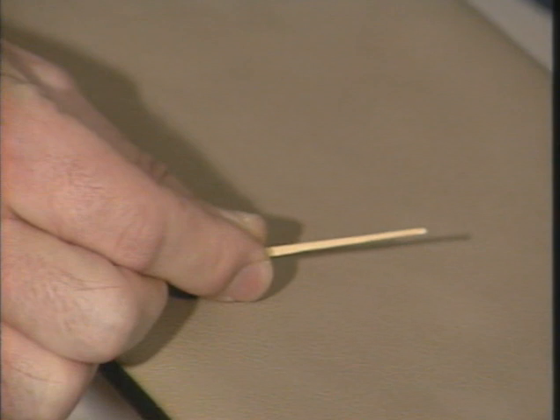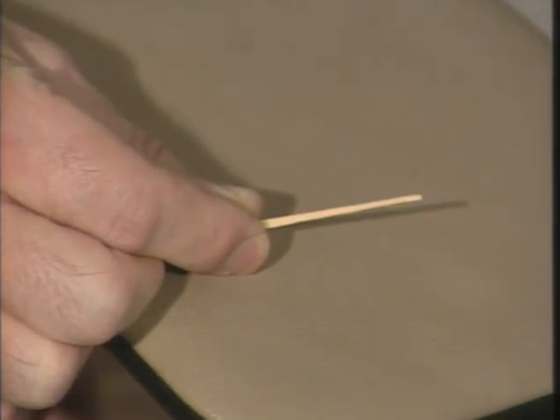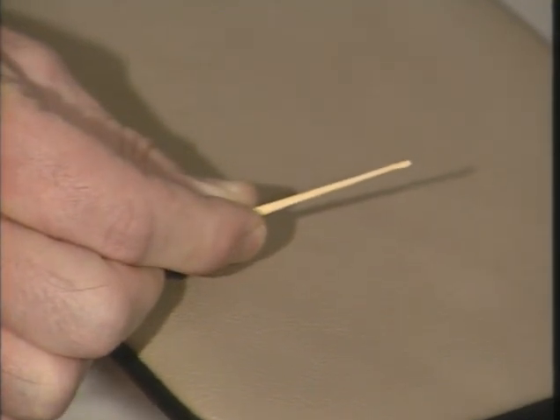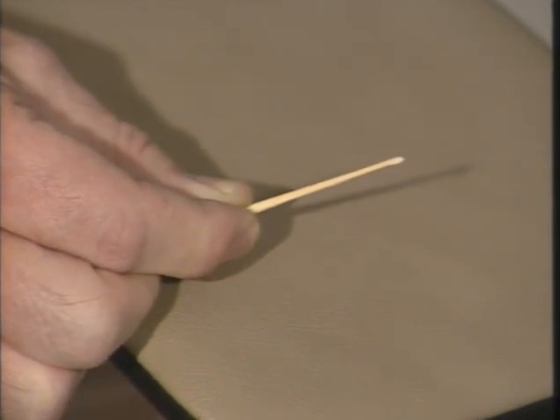When the dam is finally in position, then we can place the wooden wedges. These have two functions: to keep the soft tissues out of the way of the contact area and to prevent the rubber dam from being damaged by any instrumentation. And these long wooden wedges are particularly useful because they can be manipulated with the correct degree of force to place them properly in between the teeth.